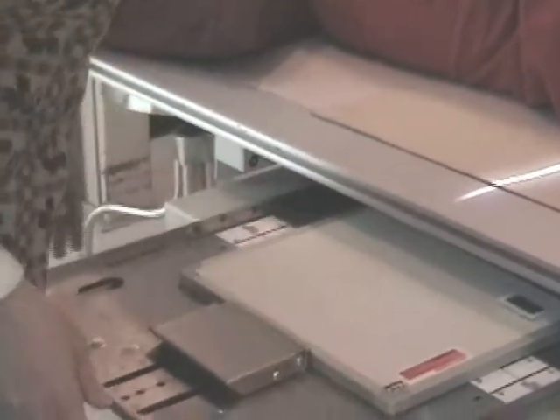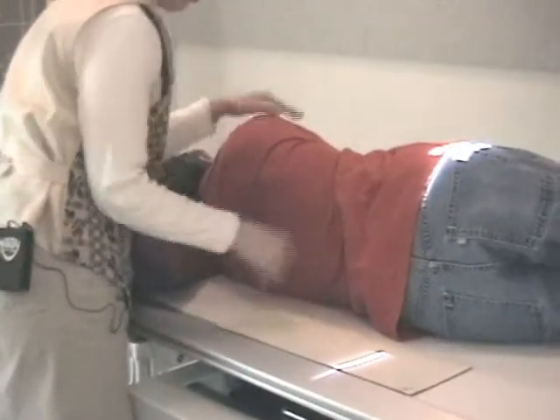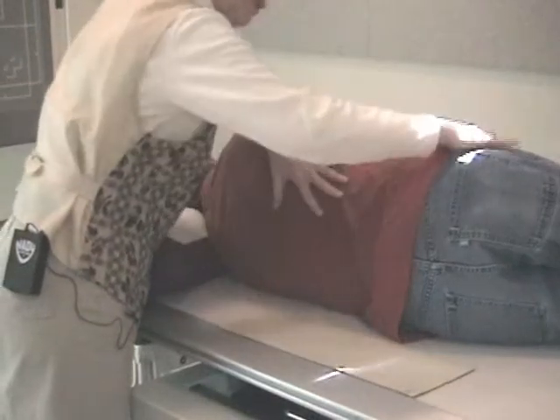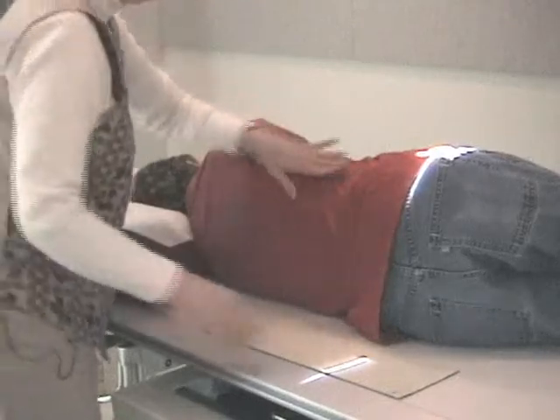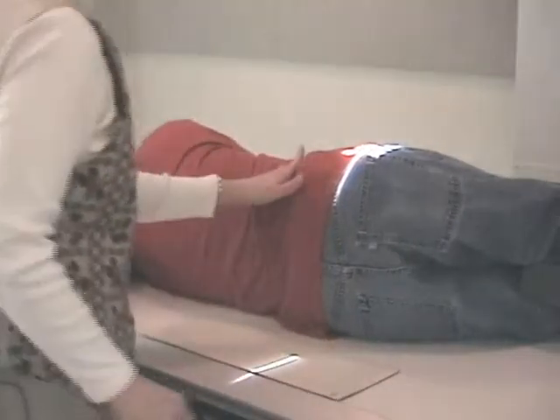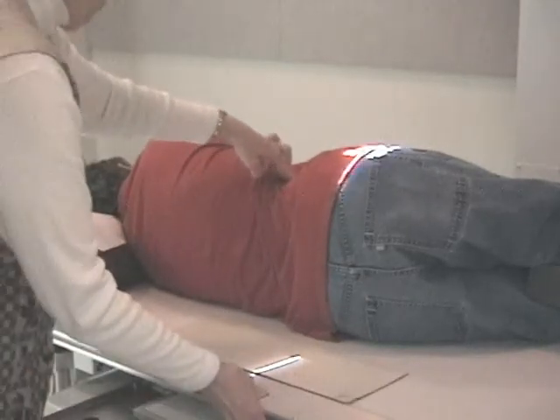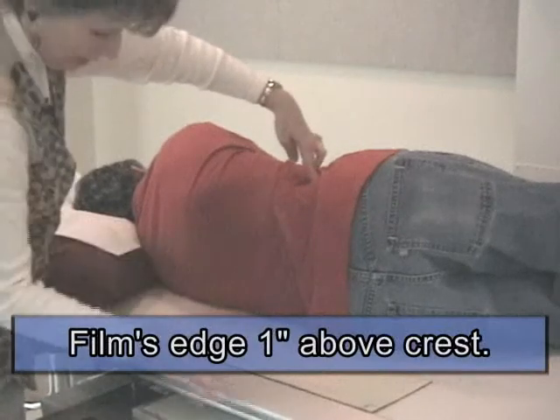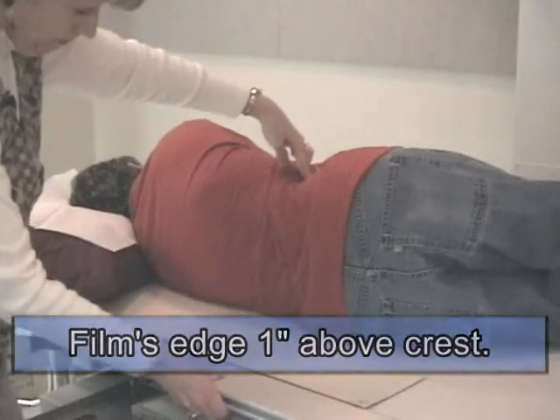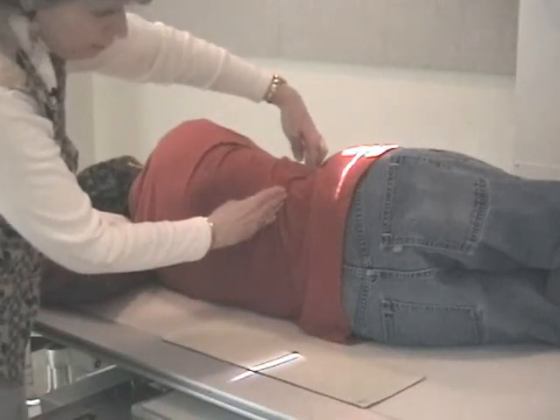Again, the tube and the film are lined up. Patient is in a true lateral position. I'm focusing on his shoulders and the small of his waist, making sure he's in a lateral position. Now I'm going to find the crest and the film's edge. Film's edge will be 1 inch above the crest. Okay, here's the film's edge, 1 inch above the crest.